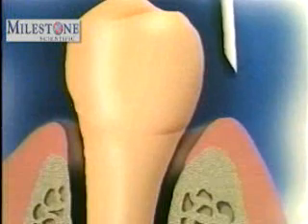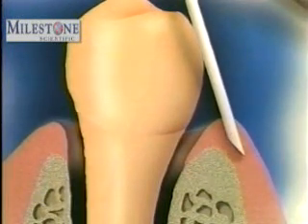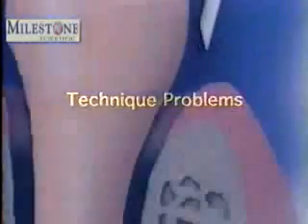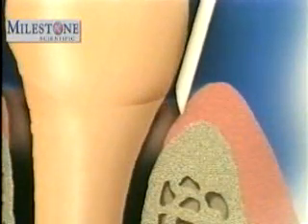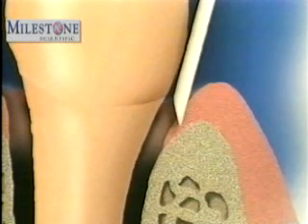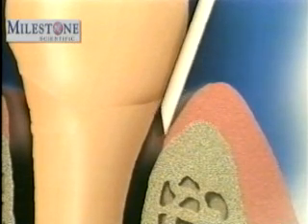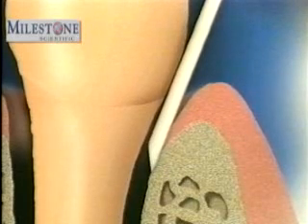If the needle shaft inadvertently deflects off the height of contour of the tooth, the needle tip may wind up in the soft tissues. This will produce a lot of blanching of the soft tissue, but will not produce pulpal anesthesia. If the needle tip is not advanced far enough into the PDL, a seal will not be formed around the needle. When the anesthetic is delivered, it'll flow back into the patient's mouth. An anesthetic doesn't taste very good. The needle should be advanced as far as it can until resistance is felt.